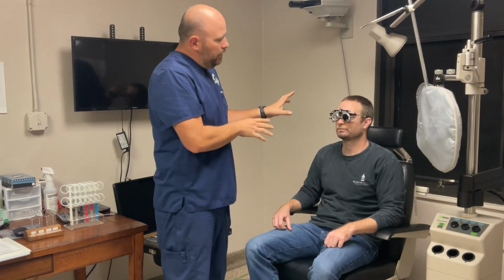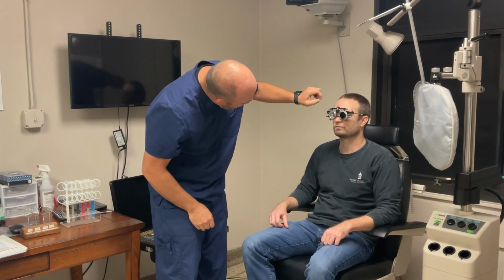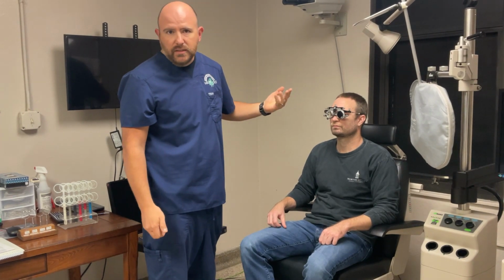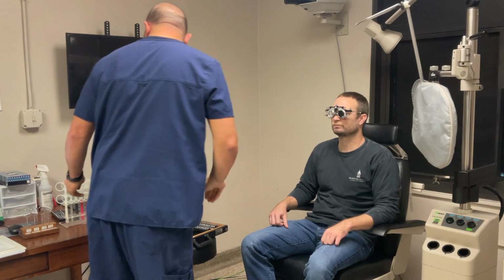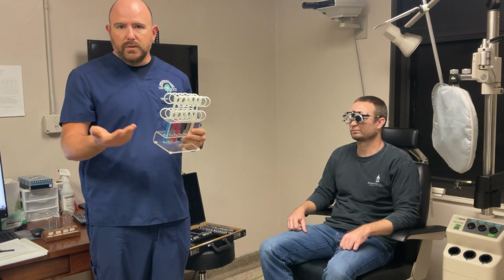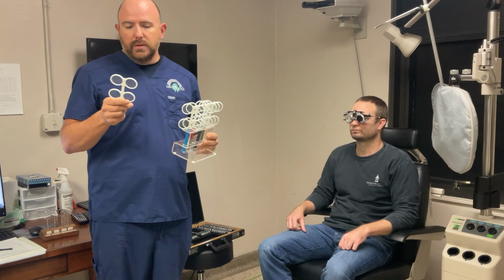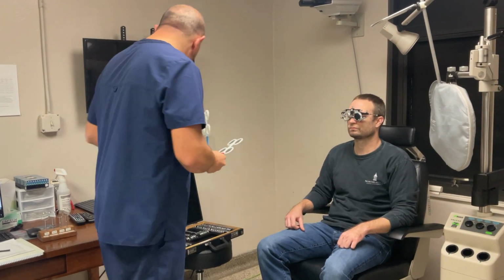All right, so we've got the frame on the patient's face, and we've also checked the PD, making sure that his eye is centered there, and we're centered in the B dimension as best as we possibly can. Now, we're going to start our trial frame refraction, and so the first thing that we're going to do is select our flipper. Since his just noticeable difference, as we've already calculated, was 1 diopter, we're going to grab a 1 diopter flipper, and so it's going to have a +1 and a -1 in the flipper itself.